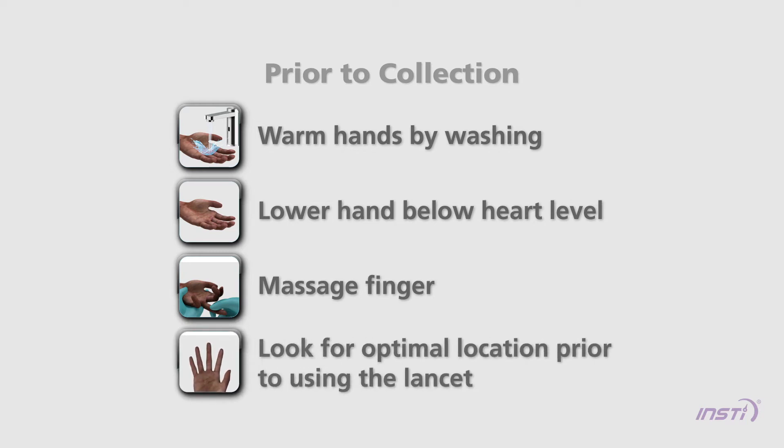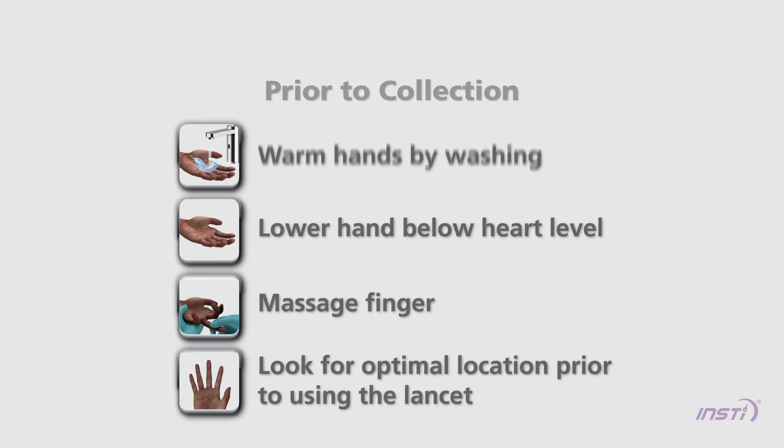Before using the lancet, look for a spot on the fingertip that is smooth, not calloused, and away from the fingernail.